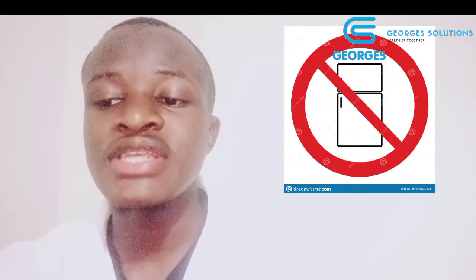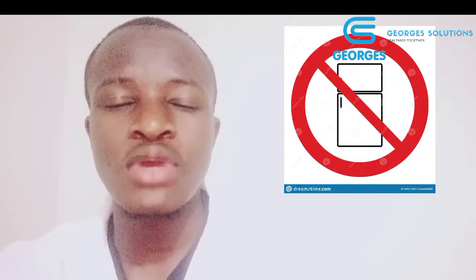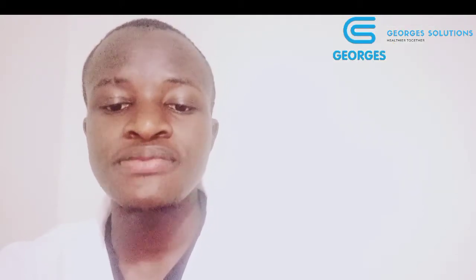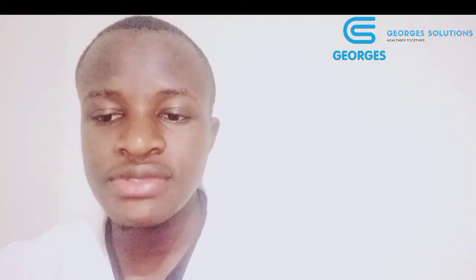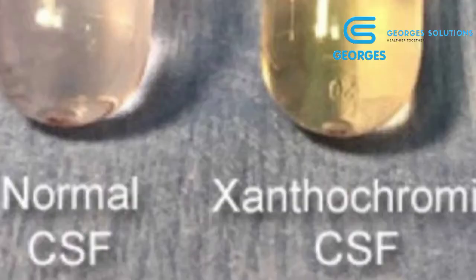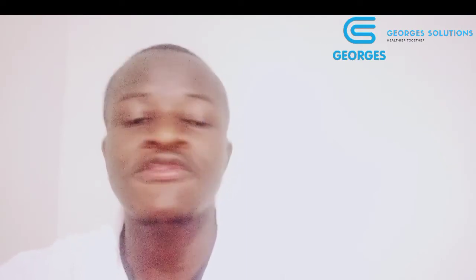And if viral studies are to be done, this is the only case whereby we can allow refrigeration. Record the procedure, start and completion times, patient status, CSF appearance, and the CSF pressure readings must be recorded. Its ionic composition is the same as that of the plasma for some components and differs from others.